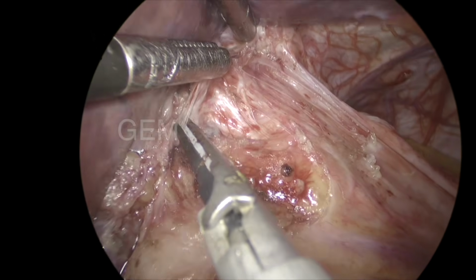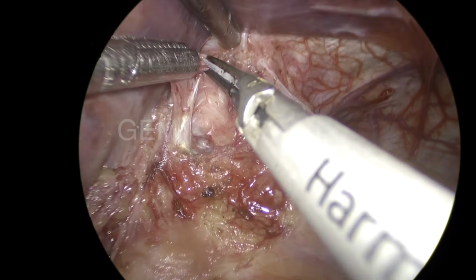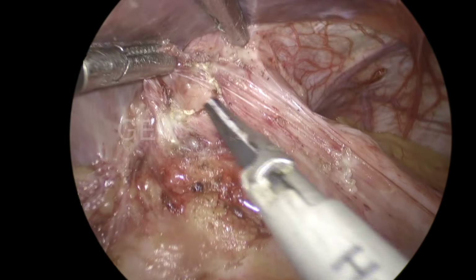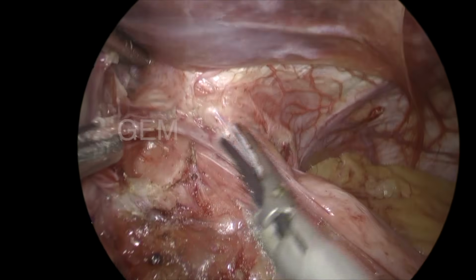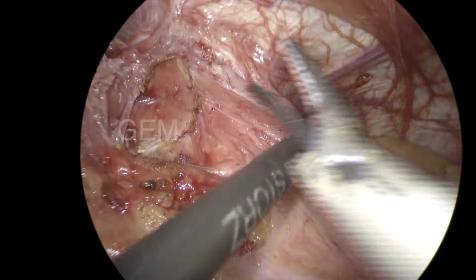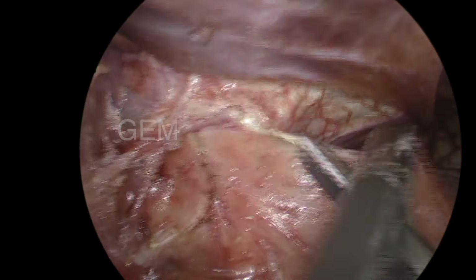So you have to give nice traction, identify the structures and divide, and do it very patiently, and keep a gauze piece. There should not be any bleeding. And here the identification of structures is of prime importance. And now you can see I did some anterior dissection. I have to be very careful. My instrument should not injure the esophagus. That is only the sac I am dividing now.